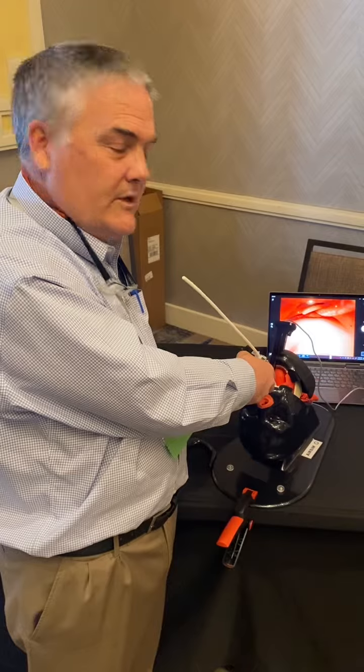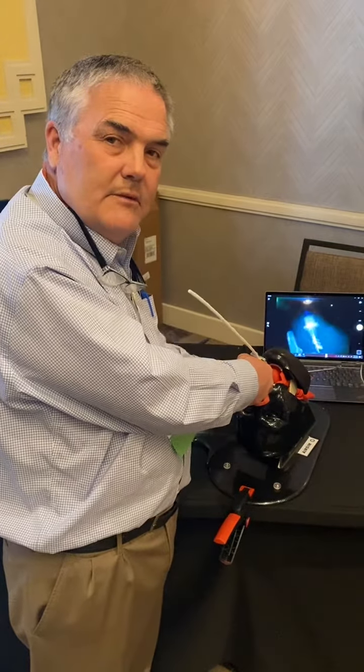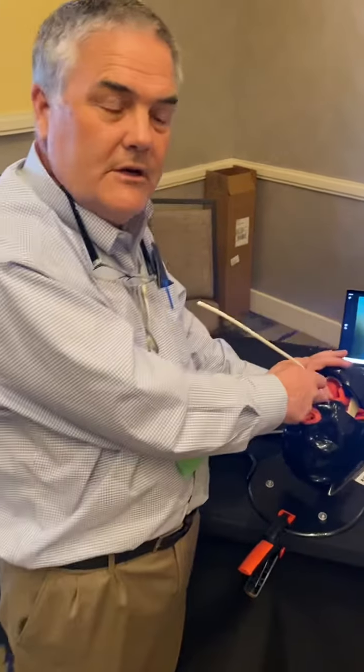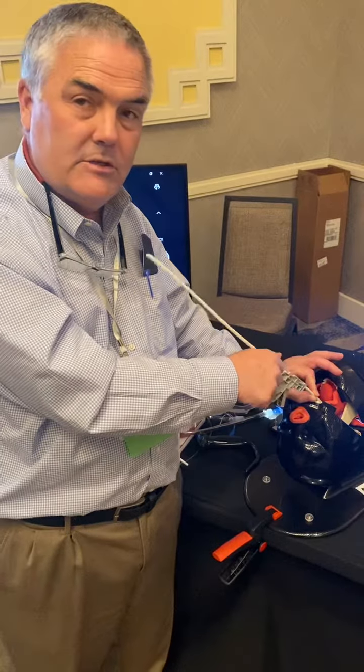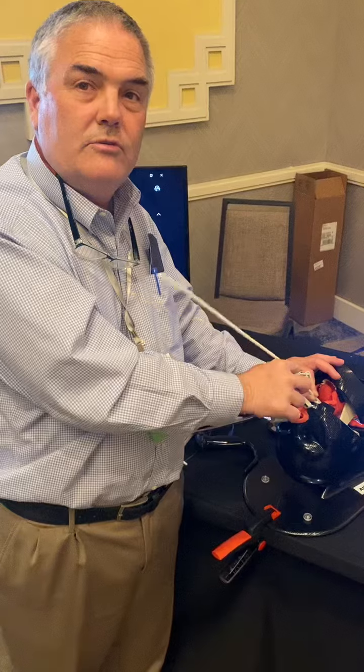Third thing is once the trachea is accessed, they can either take this out or hand it to somebody else and keep the view. But before they mess with the handle the first time, have an anchor here so that the device is secure and they don't back it out — and then the handle comes off and the tube goes over.